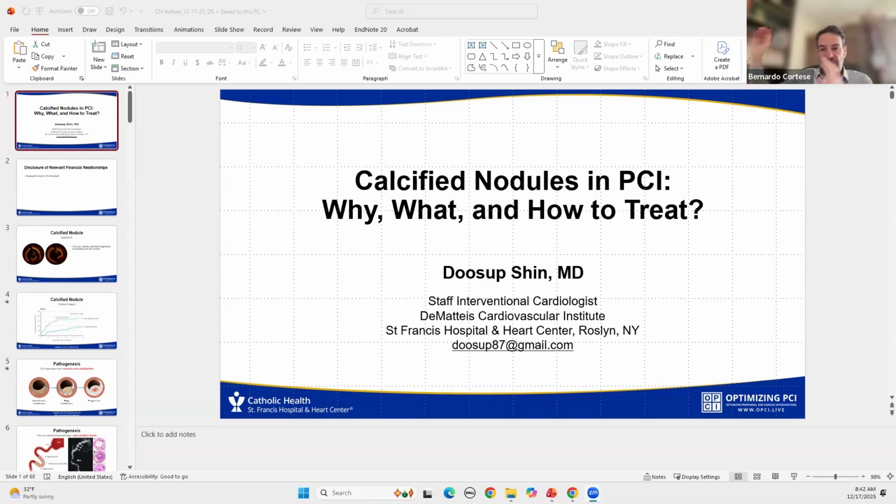And I'm telling this because we have the OCT. We treated it, it was a left main, with a stent. After 2 months, the patient came back with protrusion of the eruptive calcified nodule into the left main. You know the recurrence of that is so high, and it is left main, so she was referred to cardiac surgery. She was in another hospital, in another system. They gave her medical treatment. Medical treatment failed, and then she came back to us. And then I did another PCI.